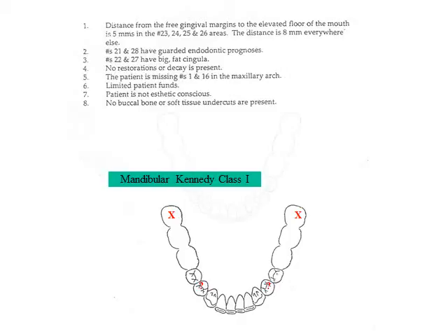Selection of abutments. 20 and 29 are the primary abutments, assuming good axial alignment, no mobility and no previous restorations. Short guiding planes on the distal of these teeth will define the path of insertion. These teeth will also provide retention and stabilization.